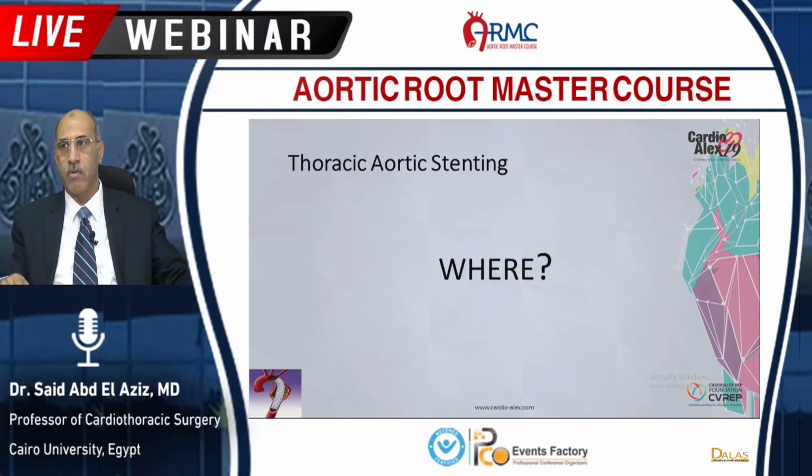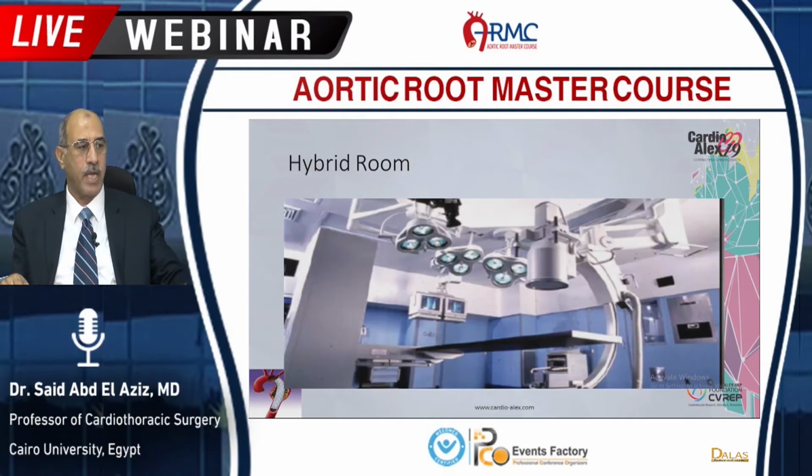So where to do the stent grafts? Usually in a hybrid suite, an operating room supplied with a cath lab. But here in Egypt we don't have the hybrid room, but we can do it in the cath lab.